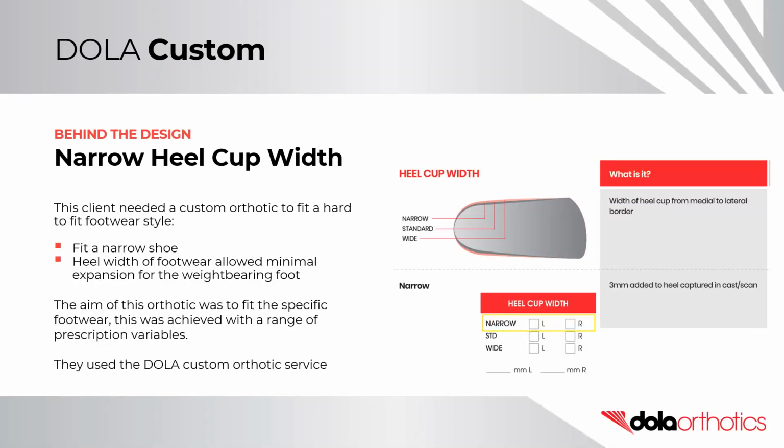Behind the design: narrow heel cup width. This client needed a custom orthotic to fit a hard-to-fit footwear style. The footwear was very narrow. The heel width of the footwear allowed only minimal expansion for the weight-bearing foot.